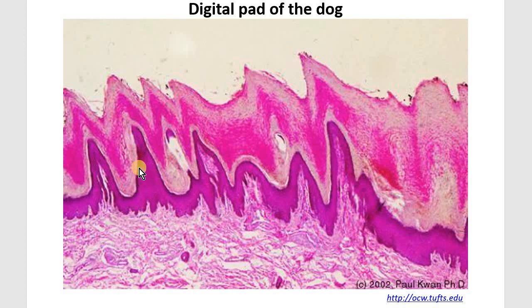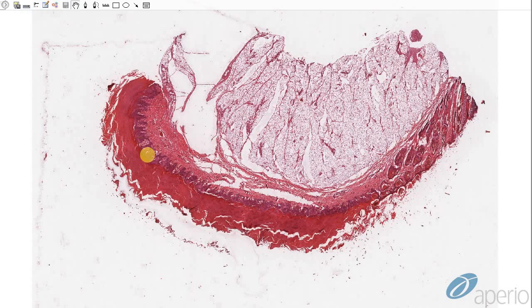This is a picture of the footpad from a dog. You can see how much thicker the epidermis is compared to regular skin, and how much thicker the keratin layer is. At the footpad-skin junction, we can see the hair follicles in the dermis.